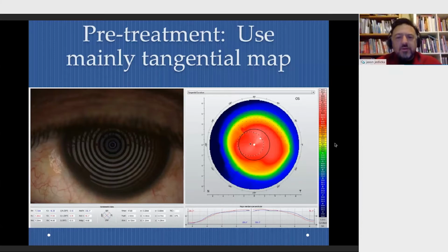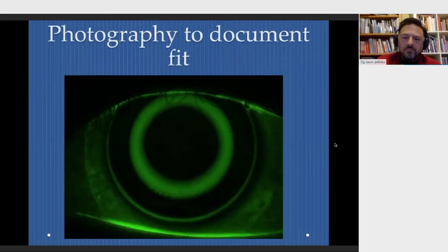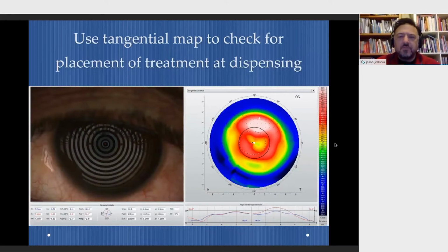And so we did some baseline measurements with our keratograph. You can see his corneal topography prior to instituting the Ortho K treatment. We fitted him with lenses. We documented the fit of the lenses with the imaging equipment. And then we began the treatment.